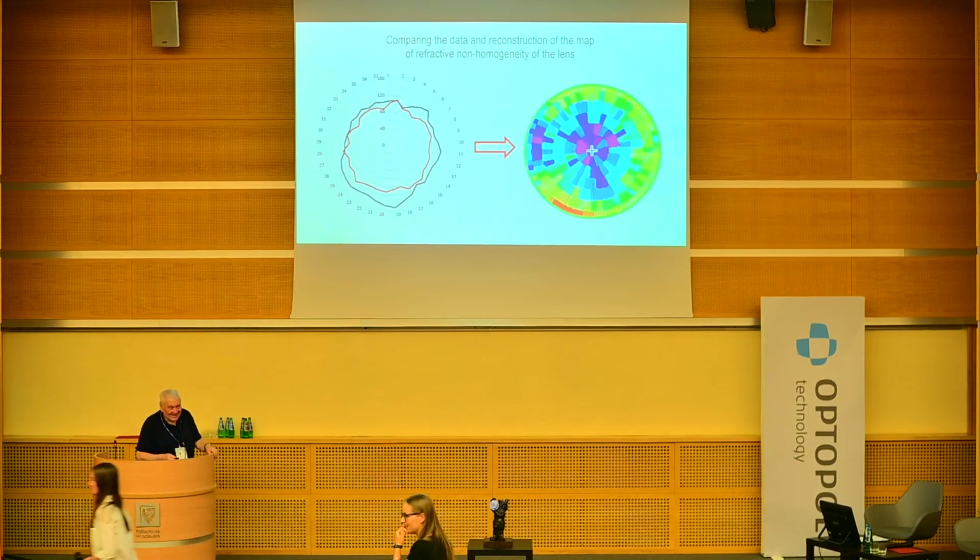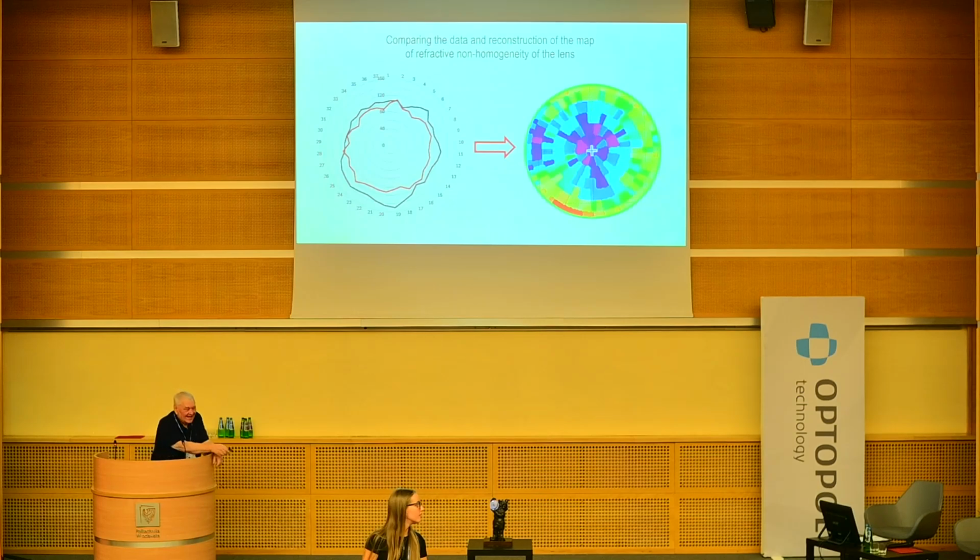Perhaps you could just explain the color coding here in this diagram on the right. Are we seeing both the horizontal tilt and the vertical tilt in one diagram? David, we have the detectors. We have horizontal and vertical lines of detectors, so that is y, x, and y.